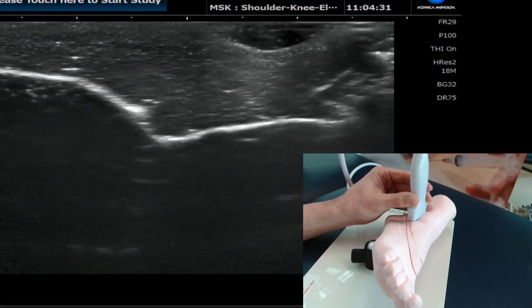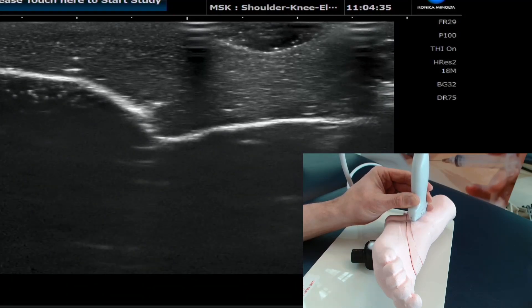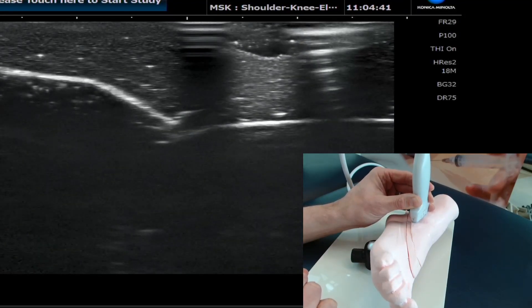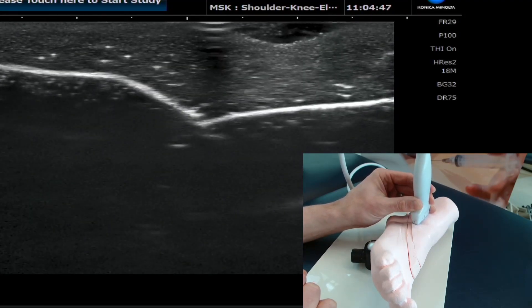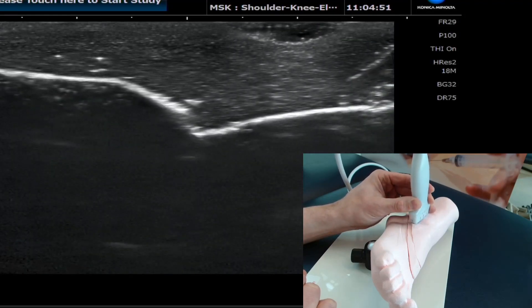This is a lateral ankle injection technique which I wanted to show you on this pretty unique phantom that we use for some of our teaching. It shows you very nicely how you can approach an ankle injection laterally with quite a superficial region of tissue, which is excellent for patient comfort.